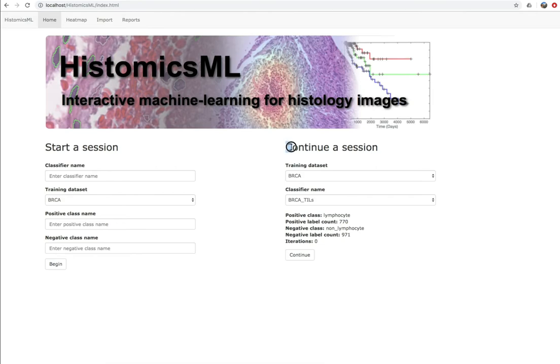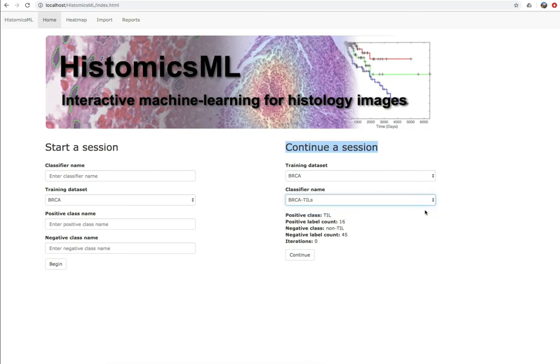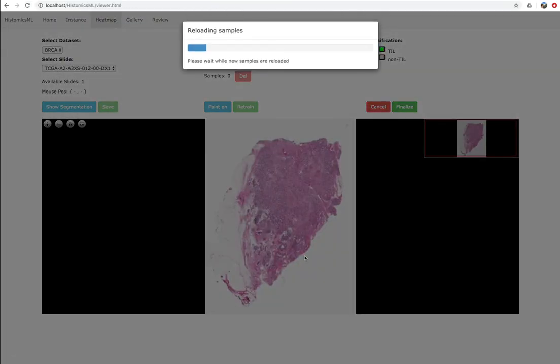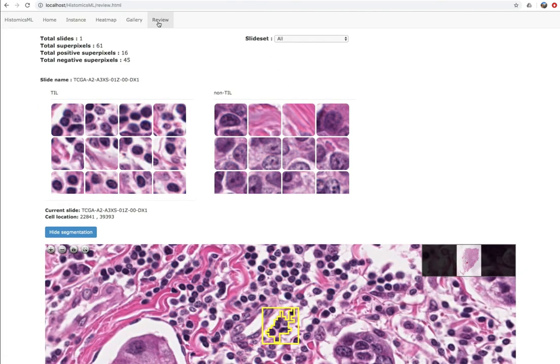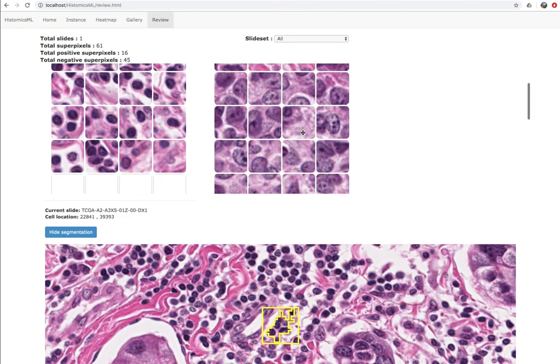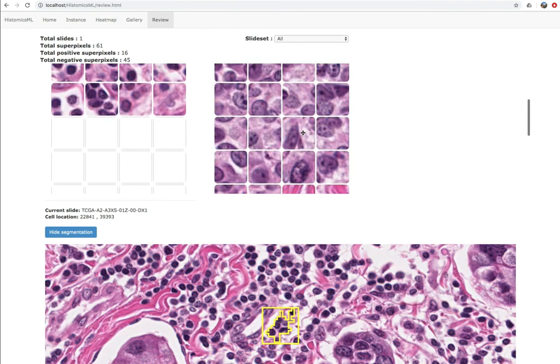Once your classifier is committed to the database, at any point in the future you can continue your training session. Just select the training dataset from the pull-down menu and select your classifier name. Histomics ML will display statistics about the training dataset and the number of labeled examples. Clicking through to continue, we can examine the review screen and confirm that our training samples are still available. From here we can resume using the instance menu or the heatmap viewer to add to our training dataset.